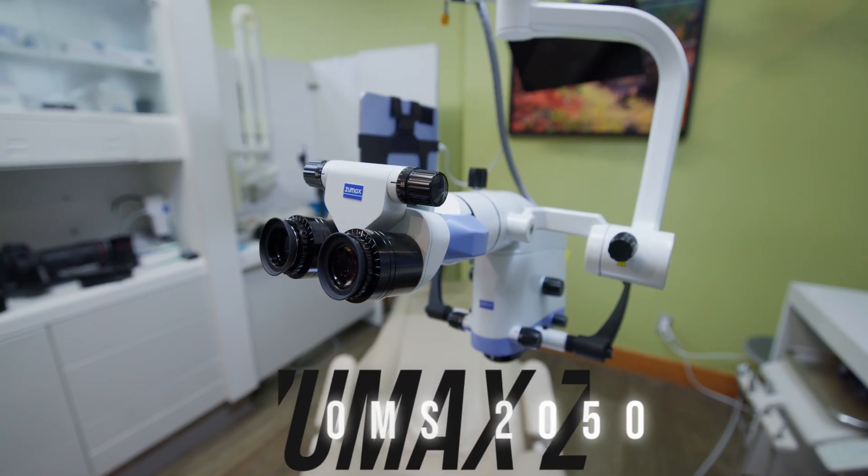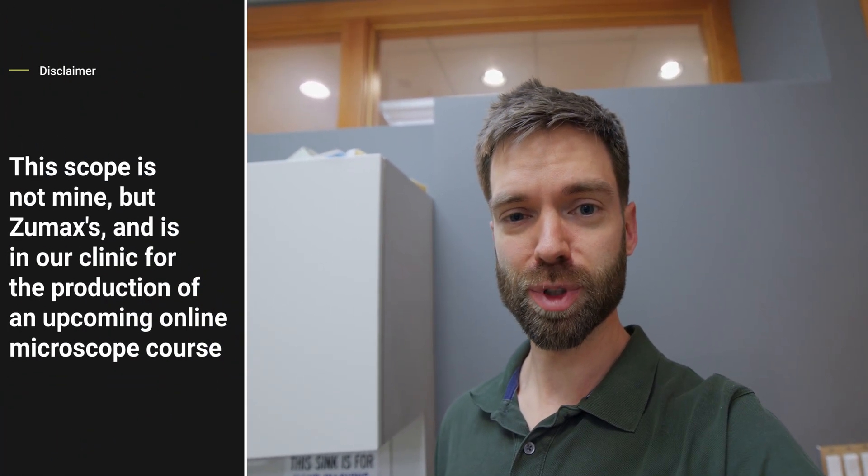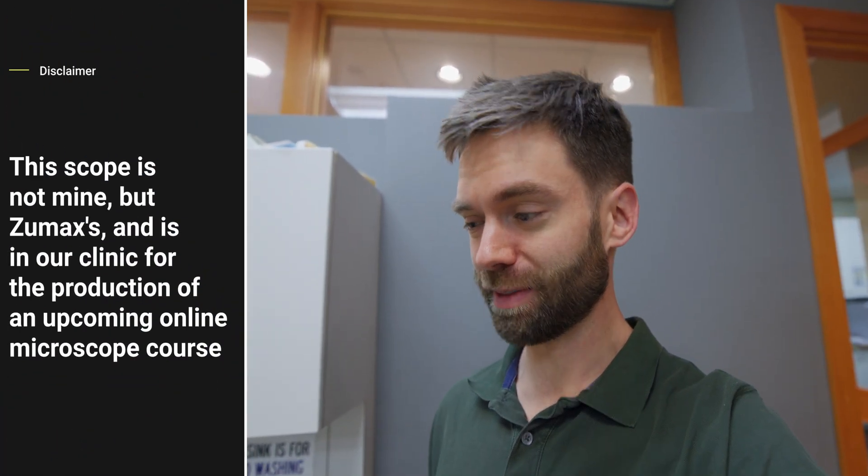This is the OMS 2050 Dental Microscope from Zumax. I wanted to give you a first look and what I think about the microscope so far. It's been in the clinic for about a week and I've had a great time with it. I'll tell you what I like, what I think could be improved, and we'll go from there.